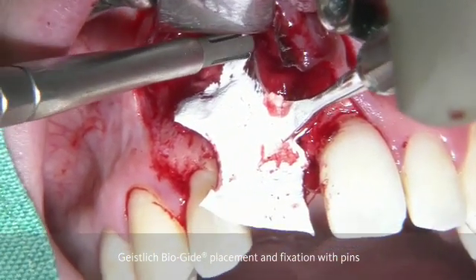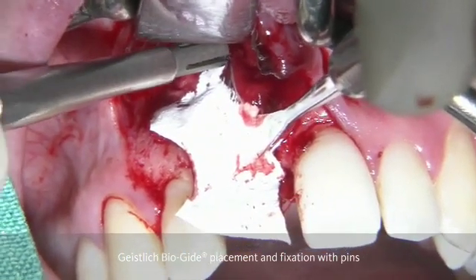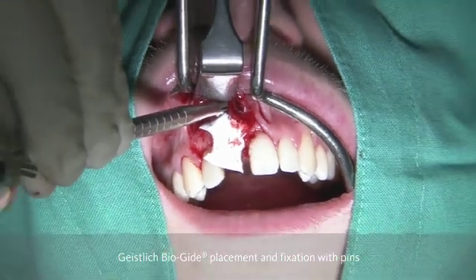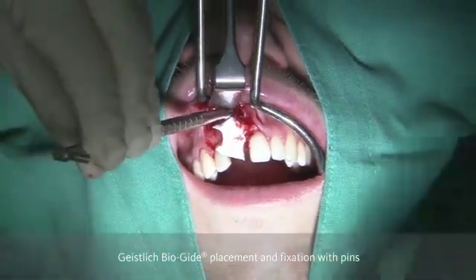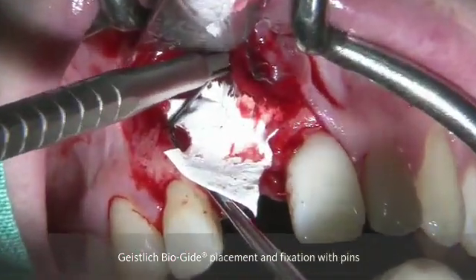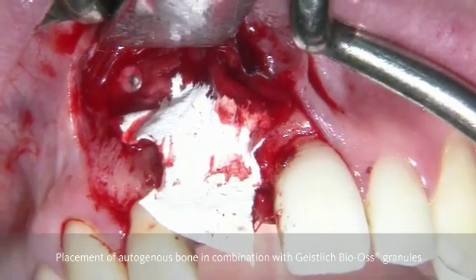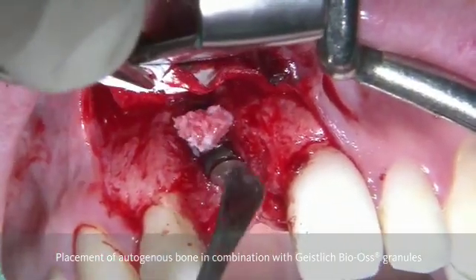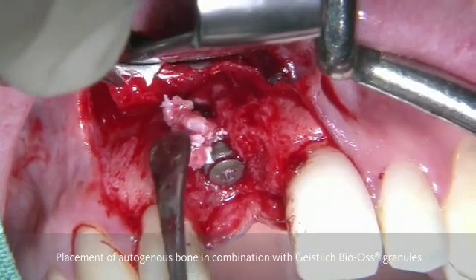In order to facilitate this process, we do multiple holes so that it is easier to find the pins. You can see here with the pin holder and the slide hammer, we can get the pins into position. This procedure is of utmost importance in order to stabilize the membrane, but also the graft material later on.